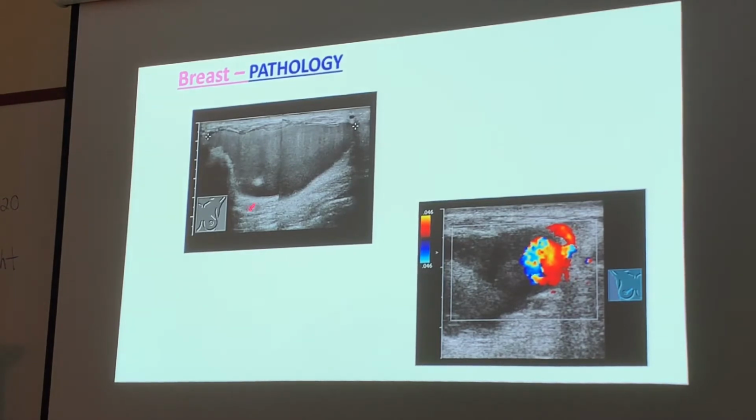Here's what we have right here, guys, a hematoma. You see these a lot, and you can see that these are really low-level echoes right here, and this whole thing is filled with blood, meaning that you won't see that leveling off because the whole cyst consists of a hematoma. It's filled with blood. Okay?